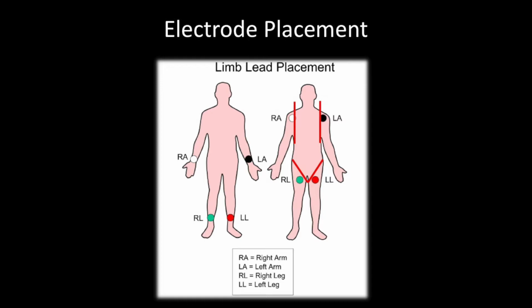Because less artifact gives you a better signal going between one to one. Say it loud. I said less artifact. Artifacts, yes, for the signal going between two. Correct. So notice a theme here: less artifact, less artifact, less artifact, right? We're going to try to do the best we can to reduce any artifact. So please use this. This is correct by the book.